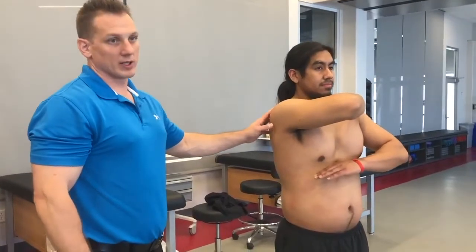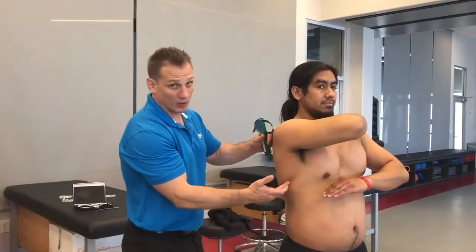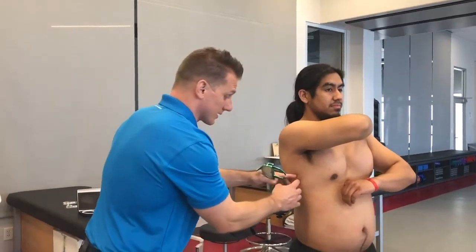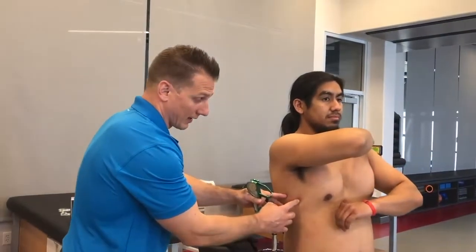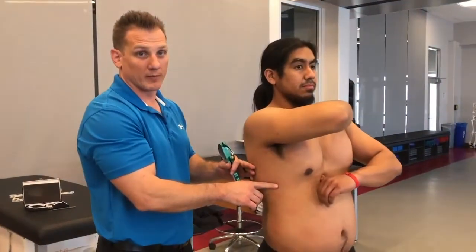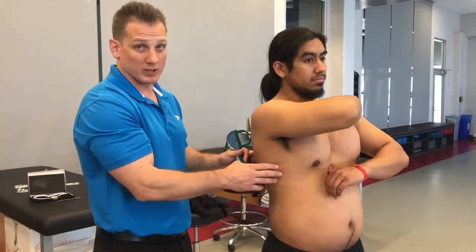Record your midpoints and whether their mid-axillary is horizontal or vertical. On some individuals who are more muscular, be careful because the lat may come across in this area. If that's the case, measure a distance anterior of the lat, take your pinch, and record how far forward you come. If the individual is not very muscular, then just take your pinch as normal.